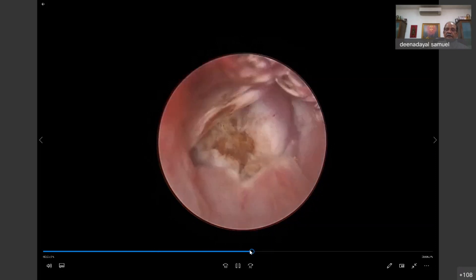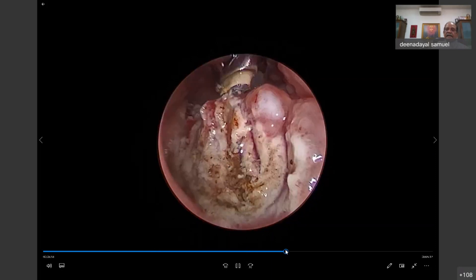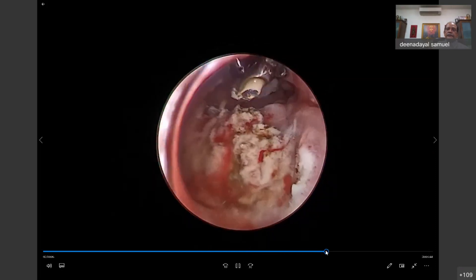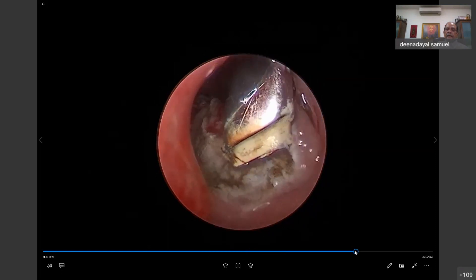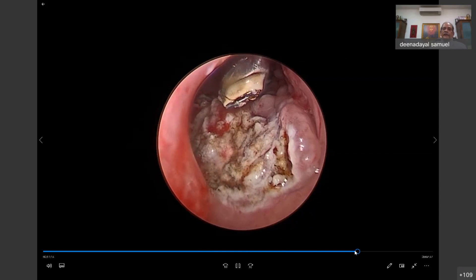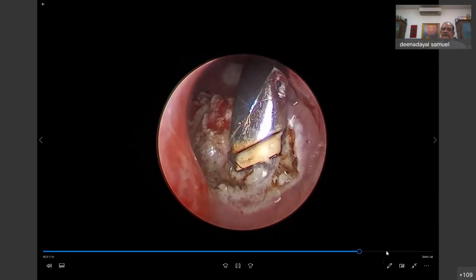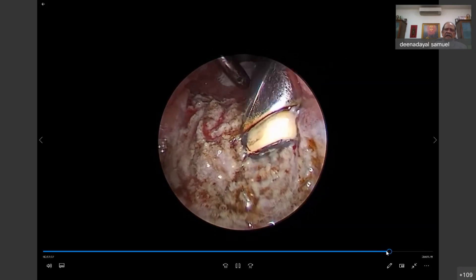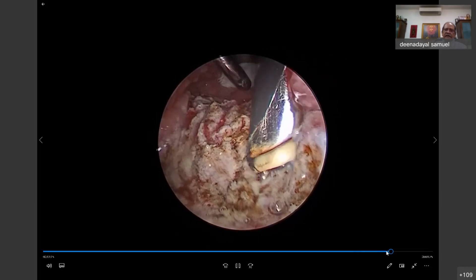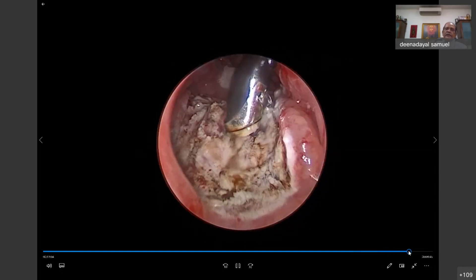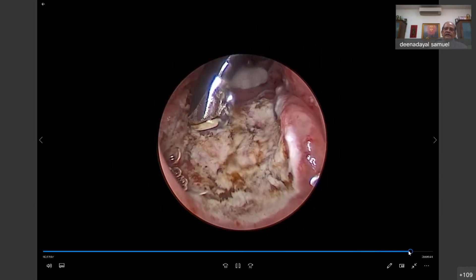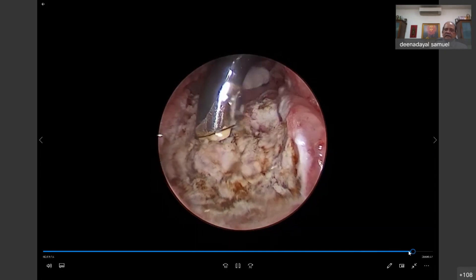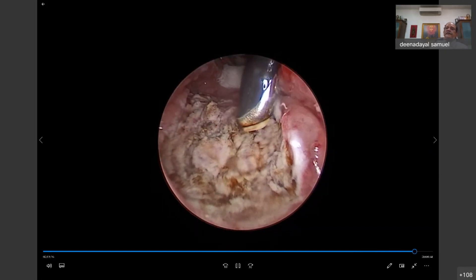This is a classical pediatric adenoid being done on the left side. For large adenoids, go in with a Procise Max. For medium-sized adenoids — grade 2 and grade 3 — you can use an Ibex. Go right up to the depth of the buccopharyngeal fascia completely, and on both sides you should be able to see the eustachian cushions.